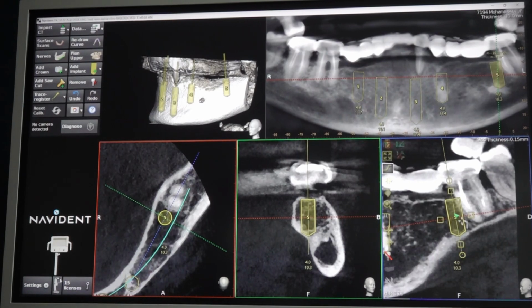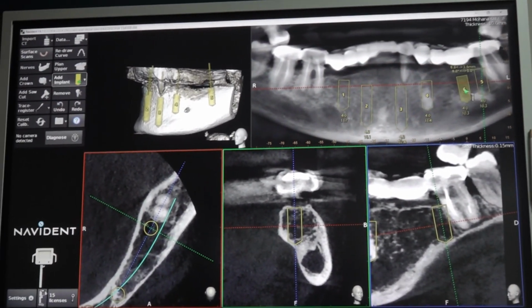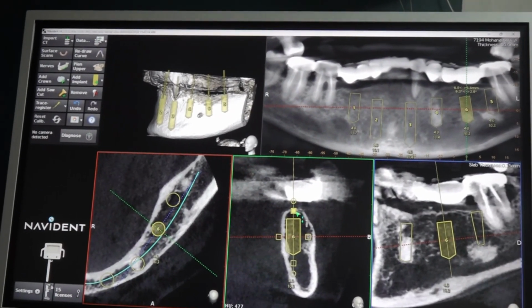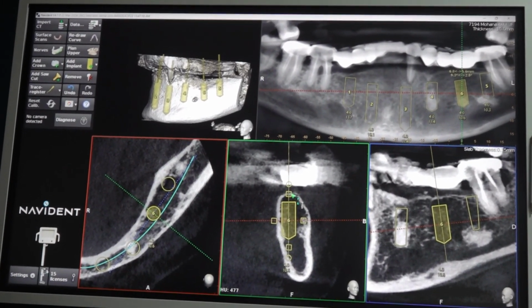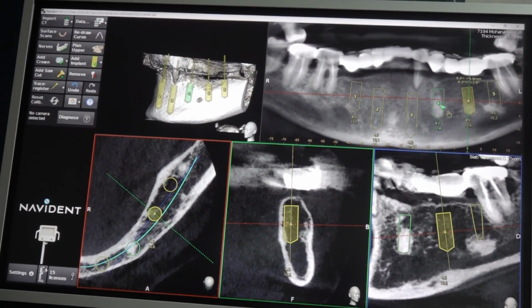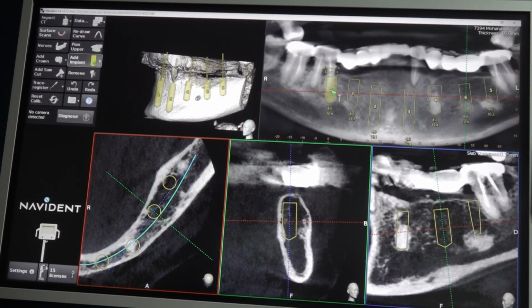probably 4 into 10, right? And one implant here, which will be a very less stable implant. Okay. By splinting, it will also integrate later. So all the implants, they are not very stable except for 1 or 2 implants. But by connecting them together, they are working.